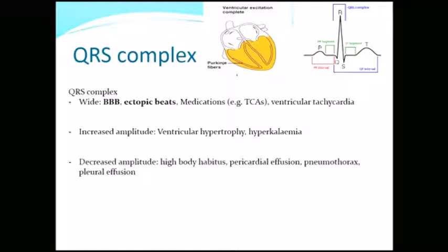Yeah, kind of. So supraventricular tachycardia just means above the ventricles, but there's lots of different places inside the atria that can cause a tachycardia. So I haven't really heard the term atrial tachycardia used. You either describe a tachycardia as sinus tachycardia, which is if it's originating from the SA node. You can have multifocal atrial tachycardia, which I showed you before with lots of funny different looking P waves. And you can also have AV nodal re-entry tachycardia, where the AV node is responsible for the tachycardia. Okay? It's not something you need to know, but supraventricular tachycardia is just an umbrella term for all those conditions.